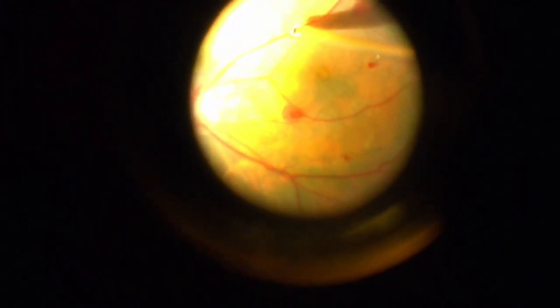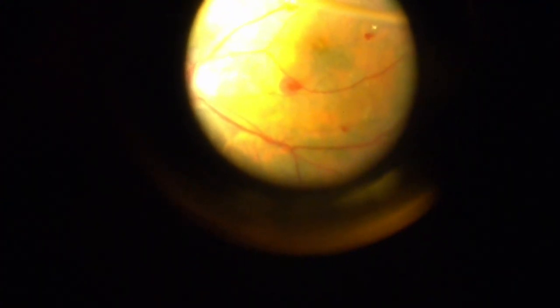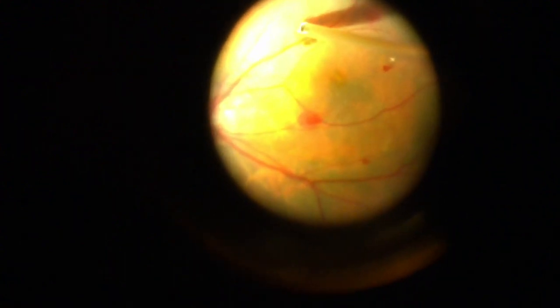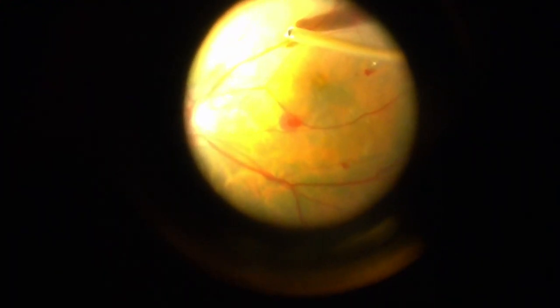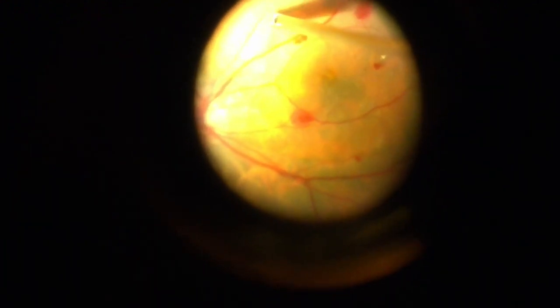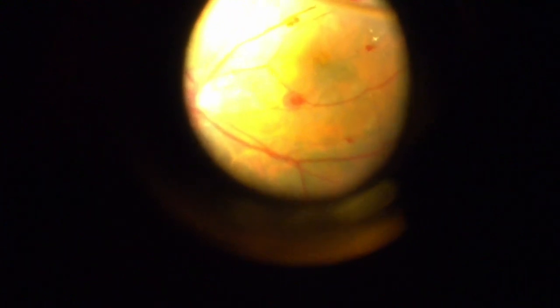So if you do engage retina, don't pull away. You're going to triple your trauma, right? But if you hit the reflux button like this, it just shoots it out. Then you can pull away. And so we'll show you this again, just because we're having so much fun, Jenny.